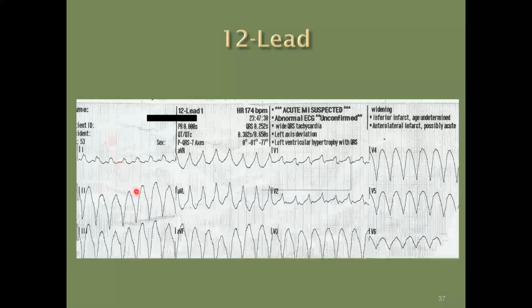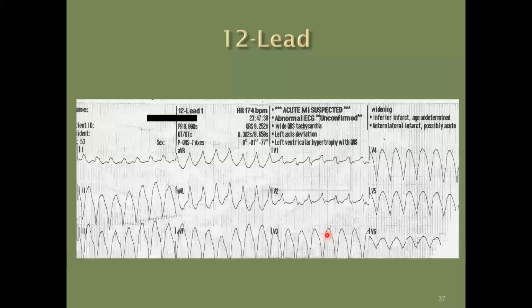All right. So if you look here, all kinds of tachycardia going on. Wide complex tachycardia. 75% of the time, if you have a wide complex tachycardia that looks like this, it is ventricular in origin. I like to look at V6. If V6 is that QS complex that we talked about earlier, then you can pretty much assure that it is VTAC. Yeah, I like that.